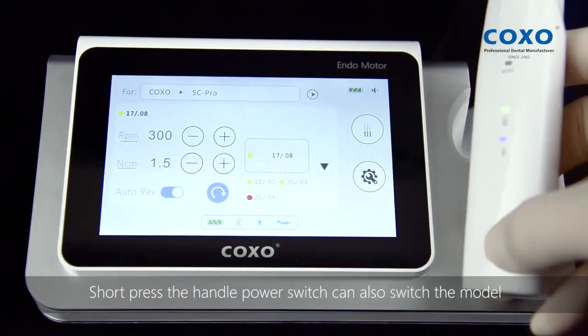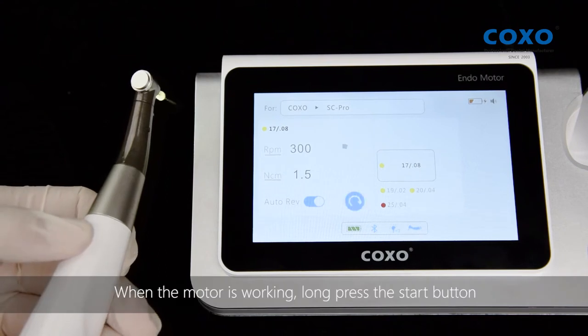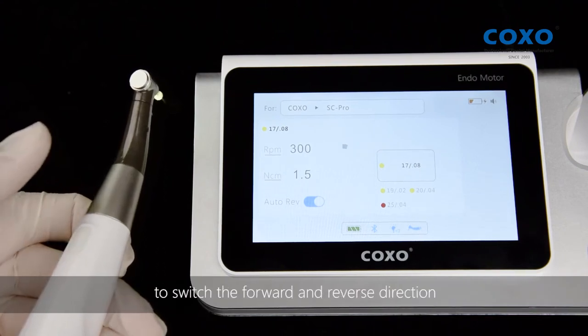Short pressing the handle power switch can also switch the mode. When the motor is working, long press the start button to switch the forward and reverse direction.